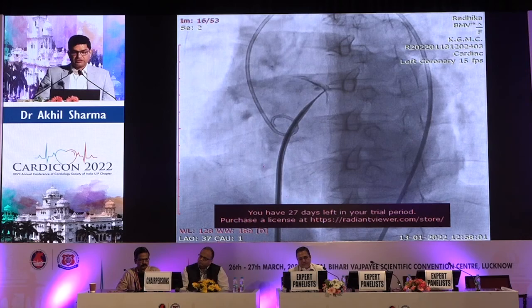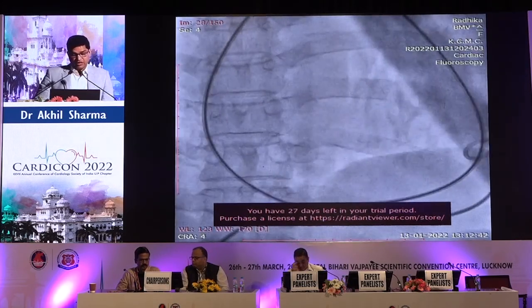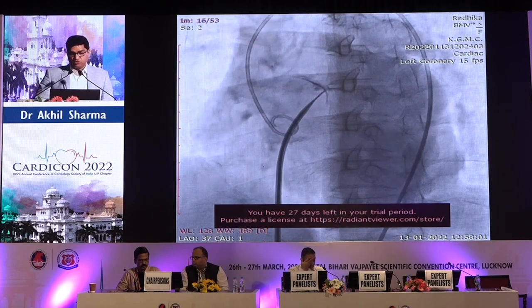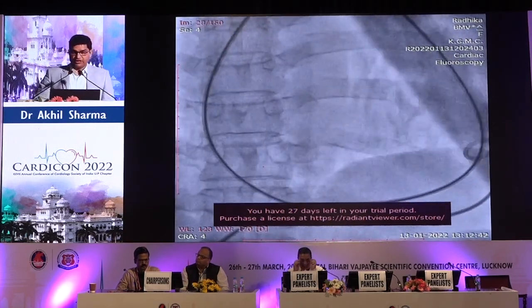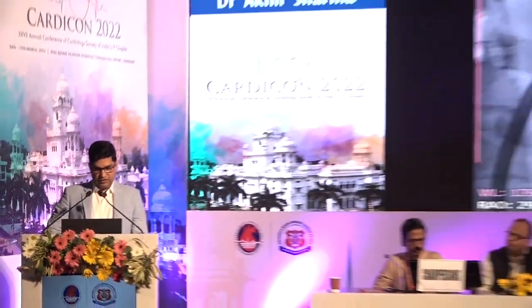So this is the case. Whenever you have pericardial tamponade in a patient, please analyze your patient carefully; you can identify whether you did something wrong. You can all identify what we did wrong. As we punctured, the patient developed hypotension, echo showed pericardial tamponade, we drained the patient and completed our procedure successfully. The patient did fine and was discharged on the second day in hospital.